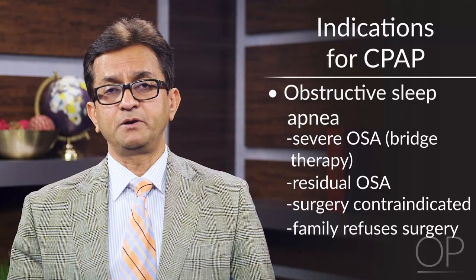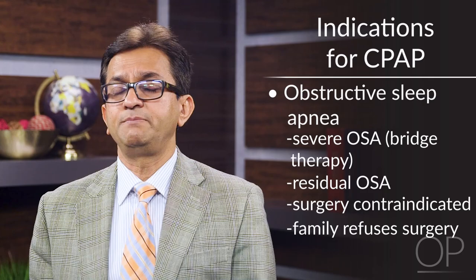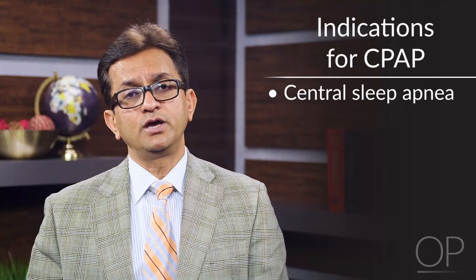Central sleep apnea and periodic breathing are other indications for using CPAP, but we typically don't use it in very severe central sleep apnea. If there is a milder degree of central sleep apnea, by improving the FRC, they can improve the oxygen reserve, which improves oxygenation, and hence you can treat the central sleep apnea.